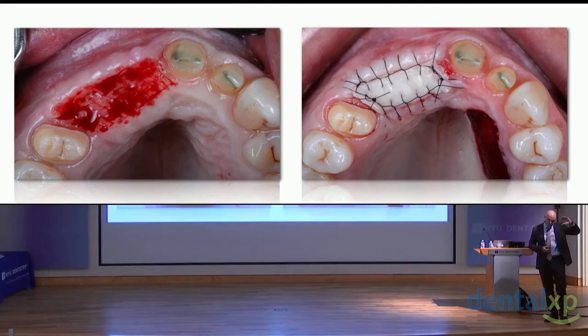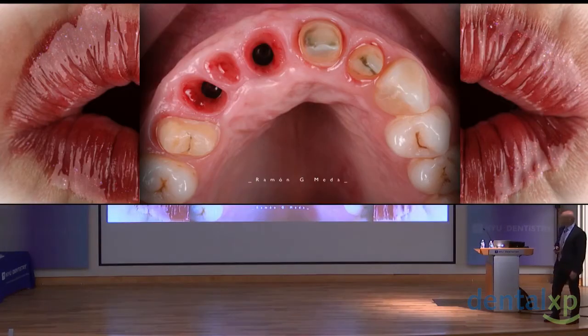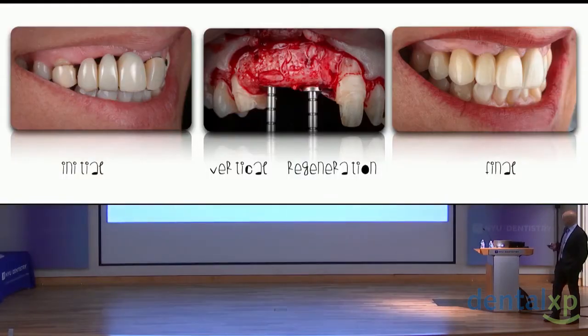In order to get not only epithelium, but also thickness of tissue, in order to get more predictability for the papillae. You know that those cases are very demanding, and sometimes we don't get the results we want. These are not really papillae, but the case was very demanding. But at least it's not a bad case. It's acceptable, I think.